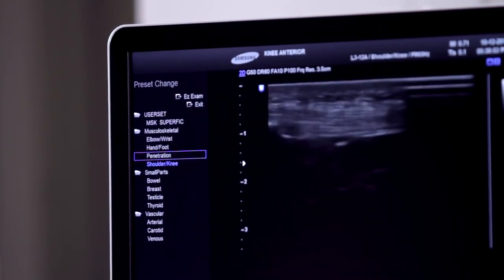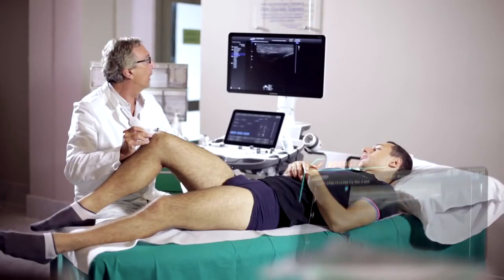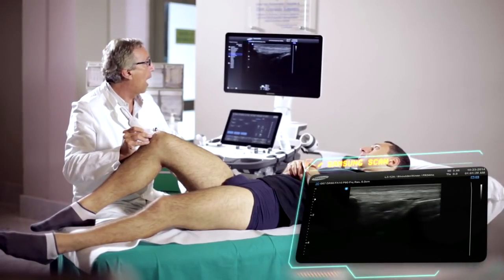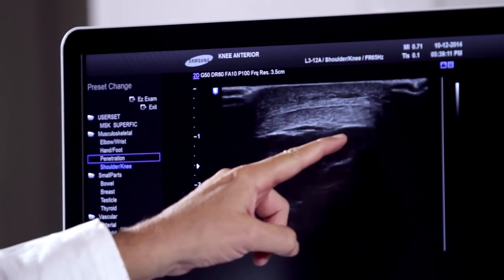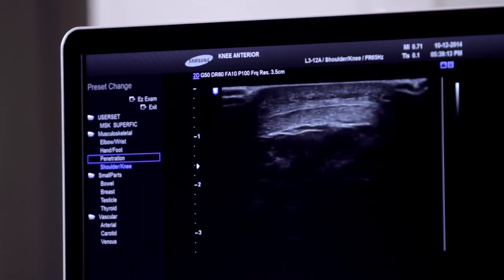This tendon may be studied very well using ultrasound scans. It is a tendon that has a thin morphology, so thin that when we do the scans internally, rotating the transducer clockwise by 90 degrees, we can see its classic thin morphology with a concave ventral profile, which is a feature of this tendon.